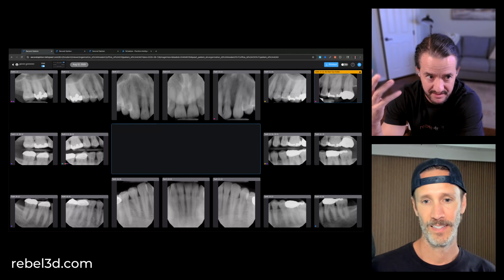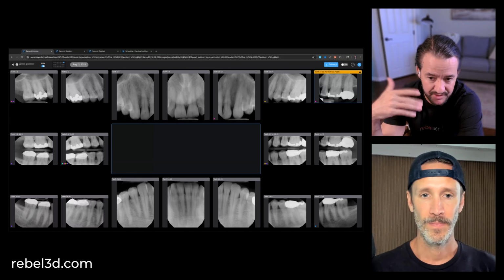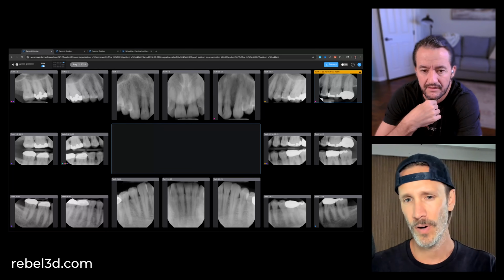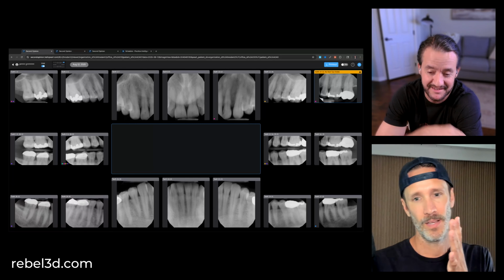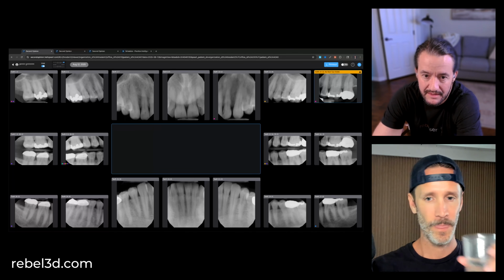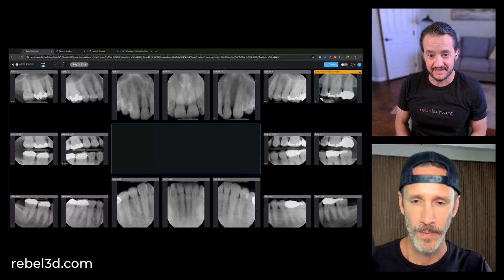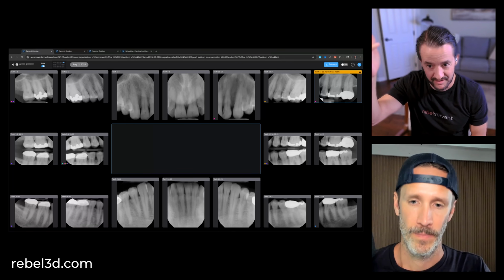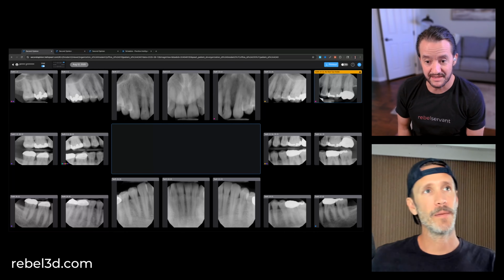And my guess is the feedback here is virtually instant. What's the process time when you upload radiographs into Pearl? It depends on your internet, but usually it's around 8 to 30 seconds. So it's instant enough, right? By the time you take the second image, the first image will be up. And so my guess is in your practice, you probably coached your staff that if you see this yellow image, then retake it before you call me. Yeah. Which is going to make your time that much more efficient.